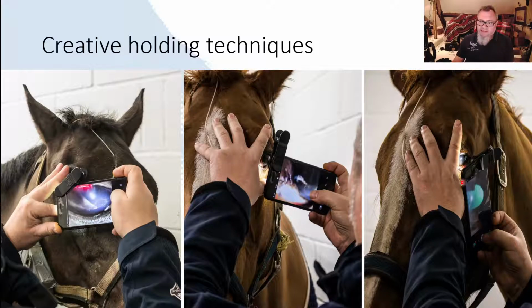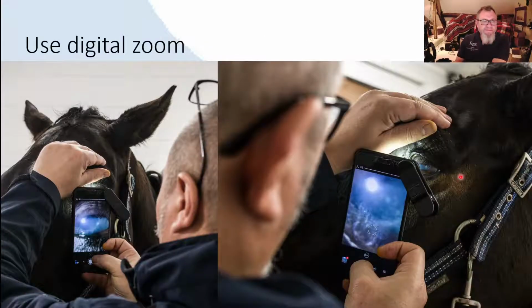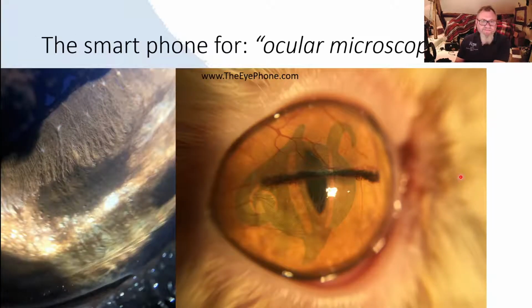In this right-hand image, I'm actually resting my phone on my thumb, which is holding against the horse's face. So you can get a bit creative about how you hold your phone, and it will help you get better images too. Once you've got a nice image, you can then zoom in, use digital zoom to see detail, and check you're in focus as well.